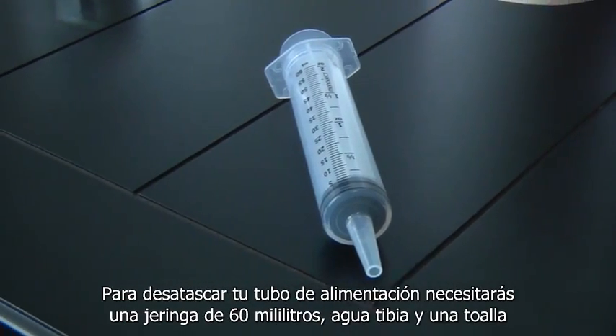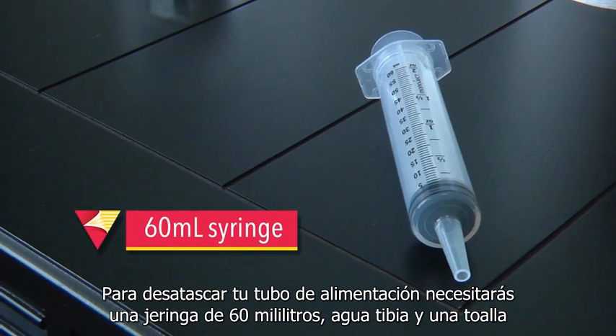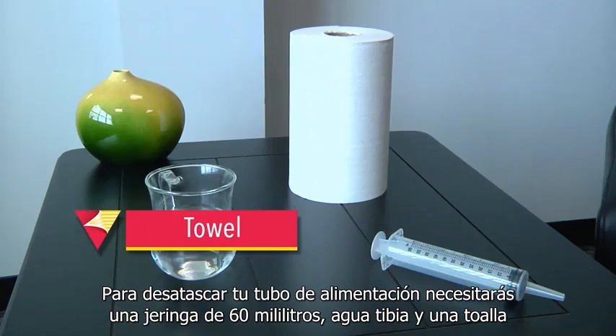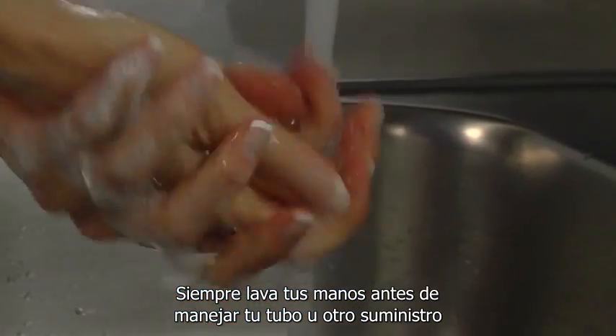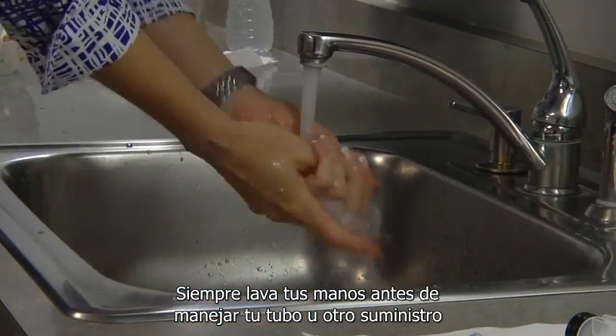To unclog your feeding tube, you will need a 60ml syringe, warm water, and a towel. Always wash your hands before handling your tube or any supplies.